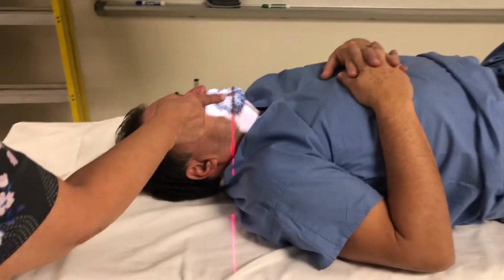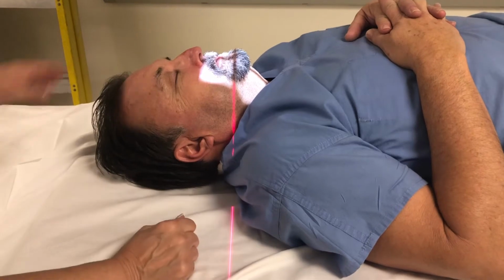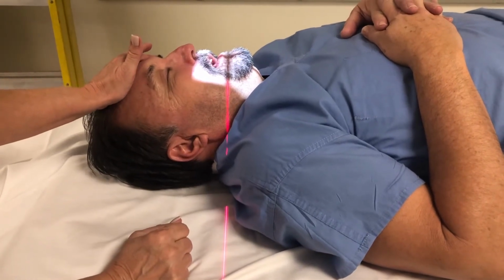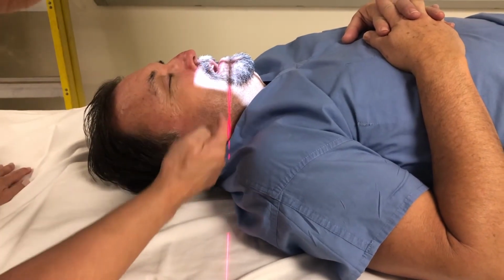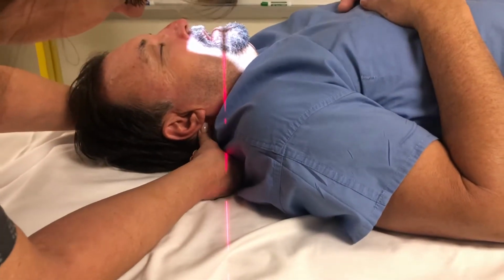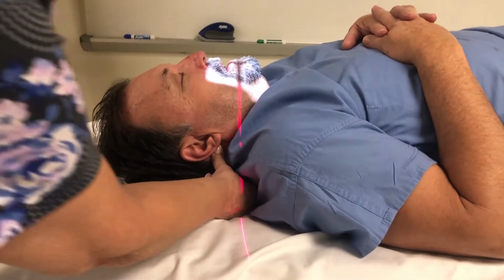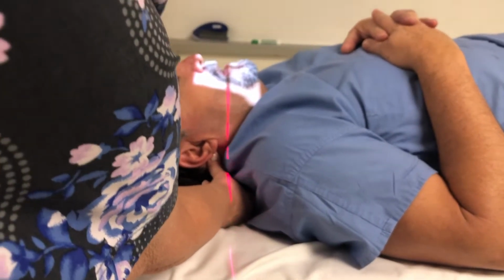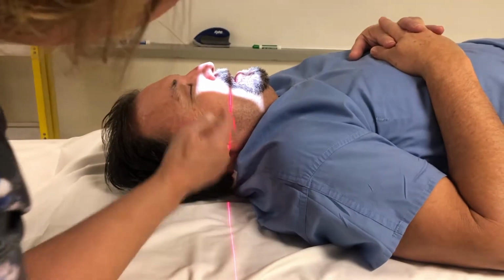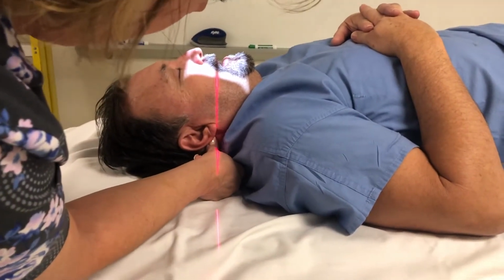Now this is nice because you can see a laser light here. So I'm going to ask him to just open his mouth slightly. Now this is just so I can see the top of his teeth. Then I'm going to feel for the mastoid tip, which is that bump that you can feel right behind your earlobe. And I'm going to line up the bottom of his teeth with his mastoid tip.